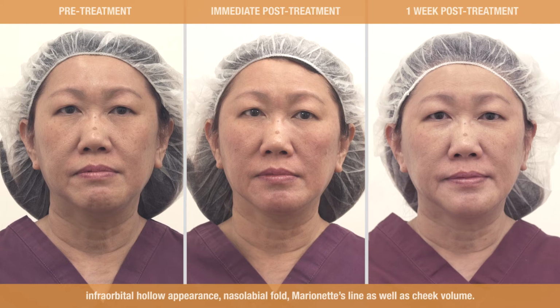This concludes the demonstration on the DL lift, which is a targeted reinflation of the facial fat compartments to produce a lifting effect on the SMAS.